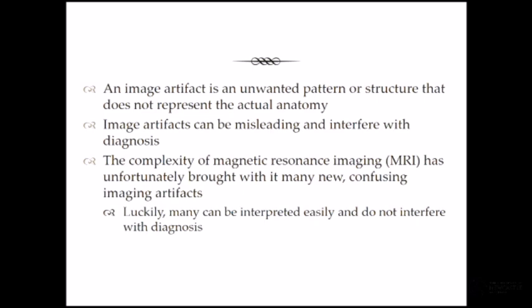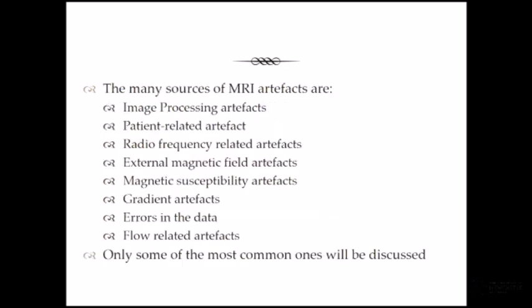The complexity of magnetic resonance imaging unfortunately has brought with it many new and confusing imaging artefacts. Luckily, many of these can be interpreted easily and do not interfere with diagnosis. So that's just an example, that inflow artefact that I told you about.